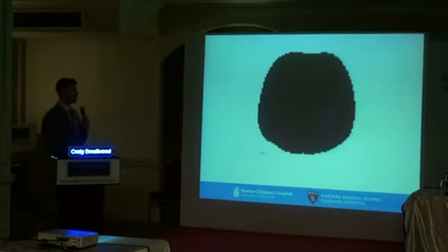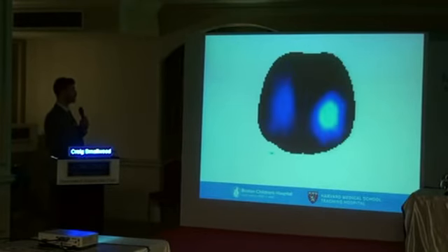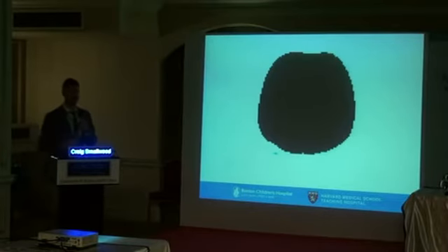So this is what it's going to look like. This is what we're shooting for. This is an actual image from a patient that I recorded and processed myself. And you can see during breathing, the patient's going to inspire, and the lighter the image, the more ventilation there is in that portion of the lungs. So this is what a typical EIT image would look like. And you can see it's not as beautiful as we'd hope.